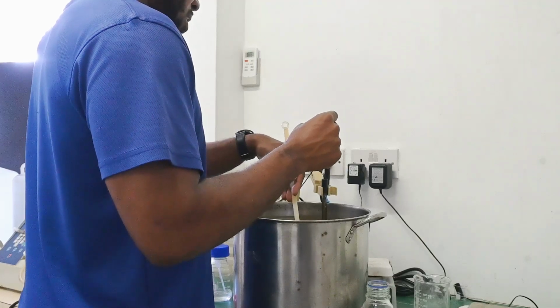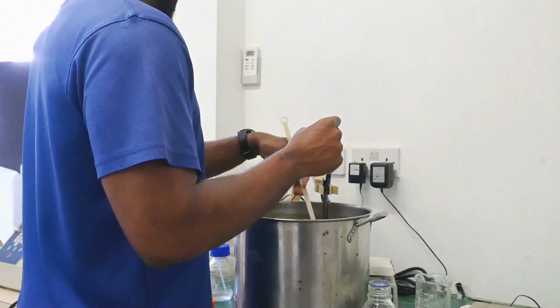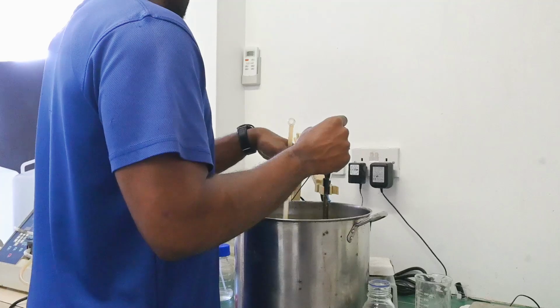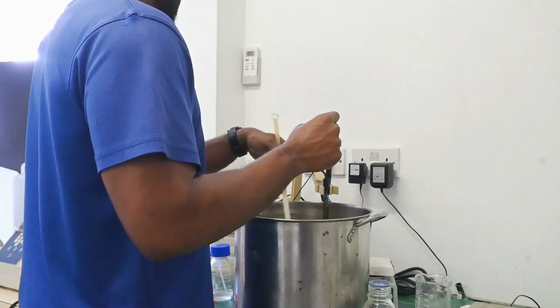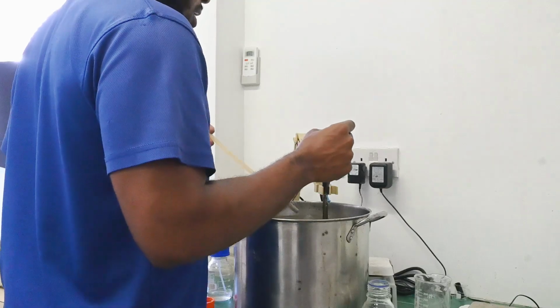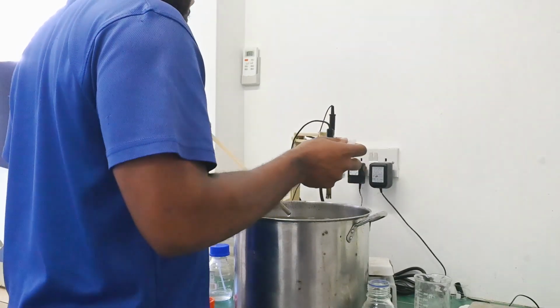So we're going to add a little bit more to get it to the 5.7. Now that it's at the 5.7 range, I can stop stirring and remove the pH meter and now get ready to dispense.